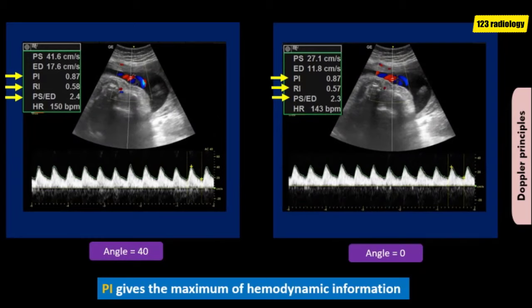Look at these two waveforms. They were obtained from the same fetus from the umbilical artery but with different angles between the ultrasound beam and the direction of blood flow. The peak systolic velocity of the right waveform is about 41 cm/s with an angle of about 40 degrees, while on the left waveform it is about 27 cm/s with an angle of 0 degrees. However, the Doppler indices — resistive index, pulsatility index, and SD ratio — are relatively the same in both, because these Doppler indices are angle-independent.